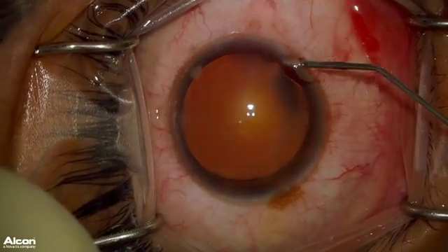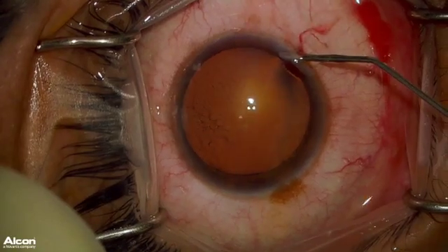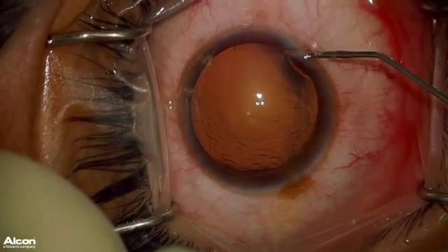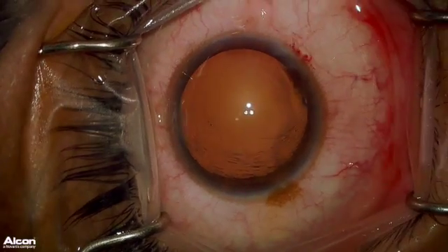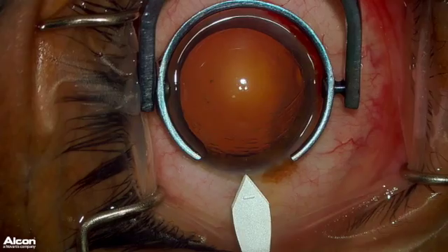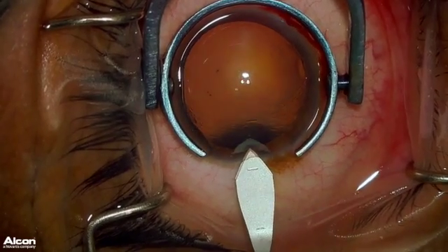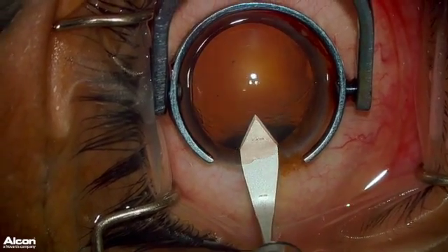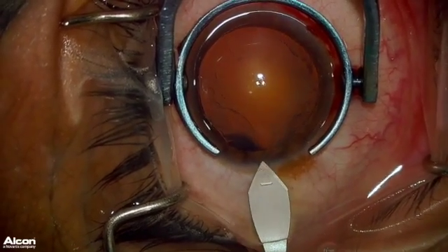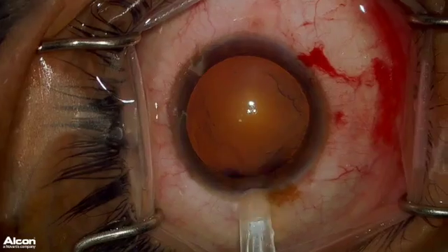I am now injecting some OcciCote into the eye to make the eye firm. I am now injecting some OcciCote out of the eye so that the eye is nice and soft.